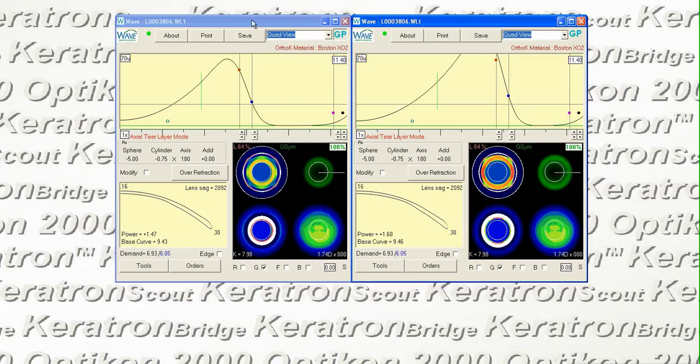So this is going to be a challenging patient, but these are the changes I would propose for the left eye. And the right eye, if the patient has been in the lenses for less than 2 weeks, I would just give that a little bit more time and see where that residual refraction kind of stabilizes.